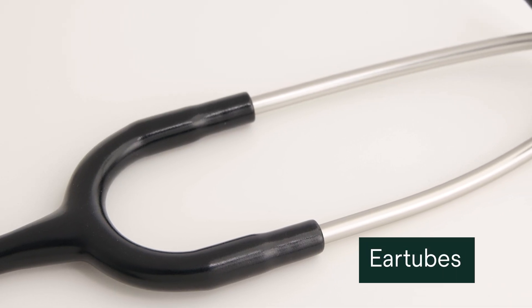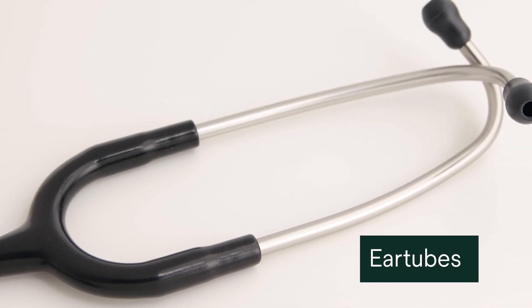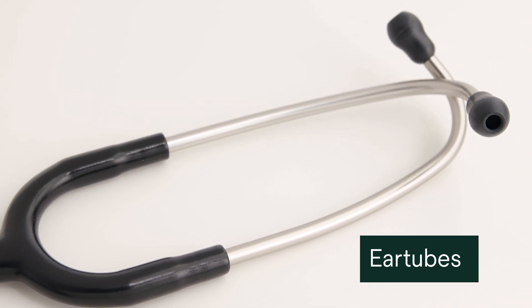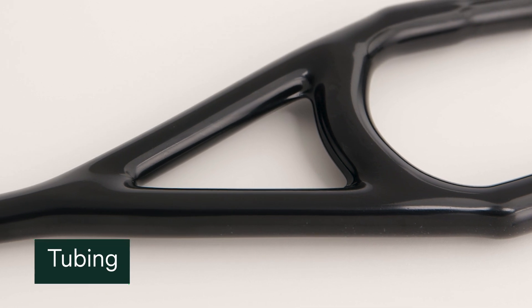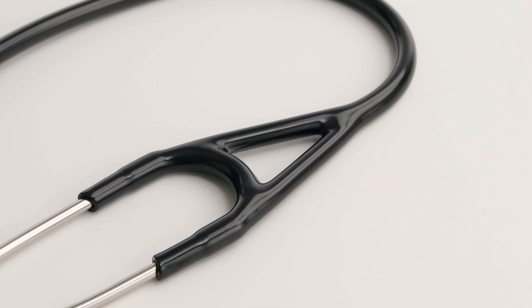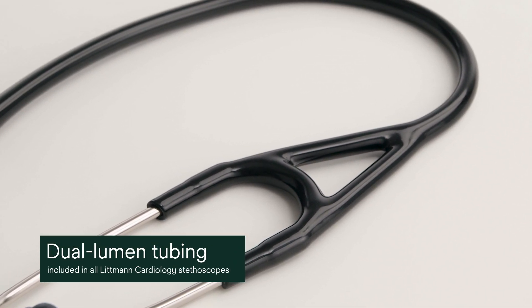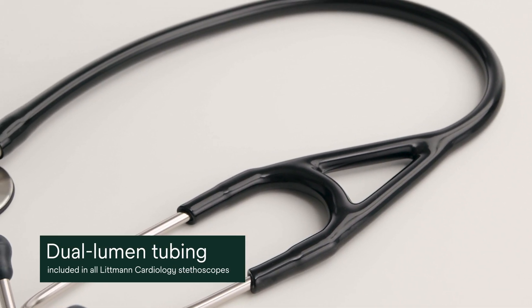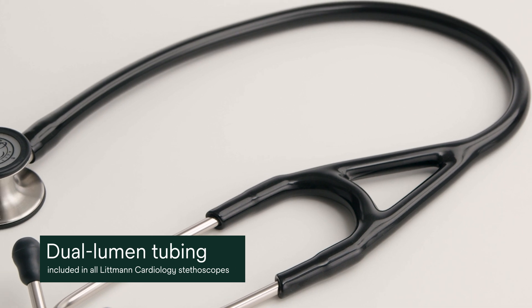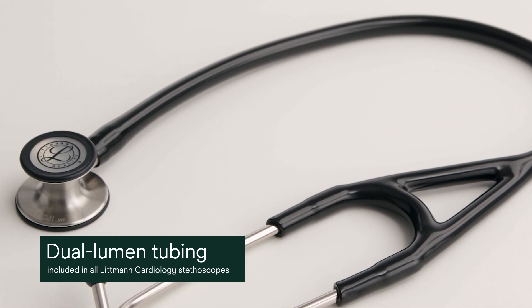Made of an aerospace aluminum alloy, the flexible ear tubes allow sounds to travel from the chest piece to the ear tips. Your Litman stethoscope provides next-gen tubing with improved resistance to wear. The dual lumen tubing in all Litman cardiology stethoscopes features two sound paths inside one outer tube, helping to eliminate the rubbing noise generated by traditional twin-tube stethoscopes.